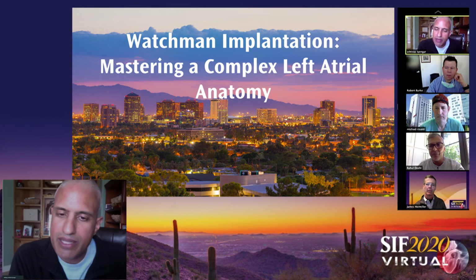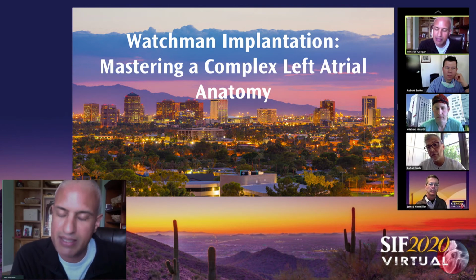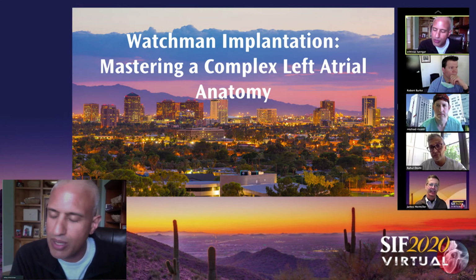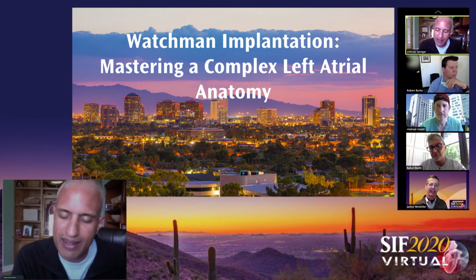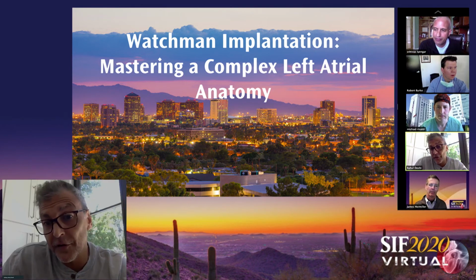And Rahul, I'll tell you, that's a great point. I think that's amazing, because my EP partner basically instructed me, he's like, why do you ICs only anticoagulate after you get the big sheath in? He's like, start the case, anticoagulate. And I was always worried about the transseptal, this, that, and other thing. And I've learned now, don't interrupt your anticoagulation, anticoagulate early in the case to avoid any untoward complication. Yeah, I think it's just a function of we've all gotten so much better at transseptal than we were 20 years ago.